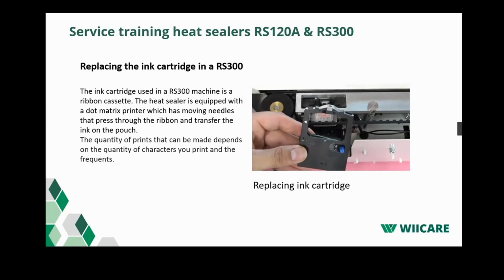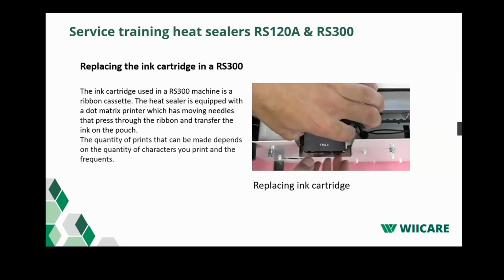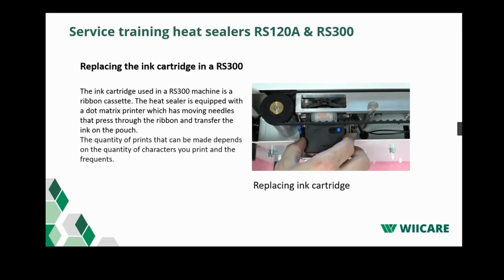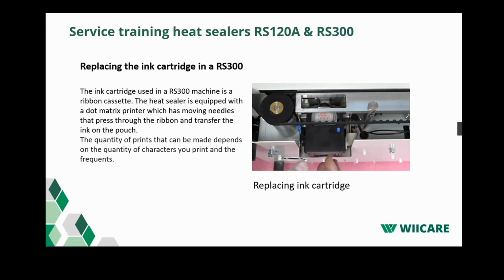Fit the cassette in reverse sequence. Push it upwards to the hole so that you can push the bottom back in. Now push the top part in its place. Then check that the ribbon is properly seated between the printer and the pressure roller. Then turn the blue knob in the direction of the arrow.